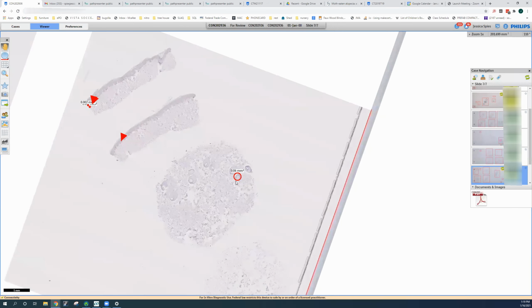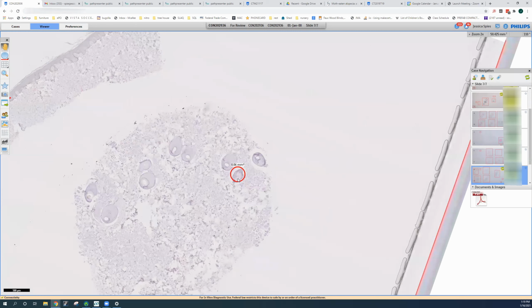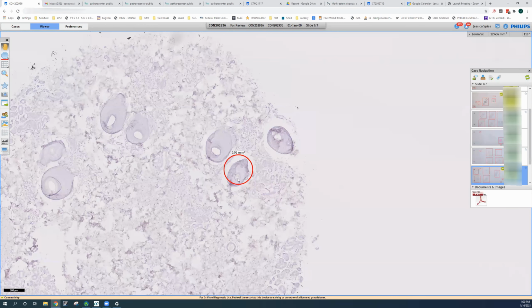So again, the features are not entirely specific, and the diagnosis rests on identifying the spirochete, or on the clinical appearance if the spirochete isn't present, and the serologic studies. I just want to note that this is an immunohistochemical stain for spirochetes. In the past, organisms were identified with silver stains and dark field examination, but now we have this much more sensitive method.